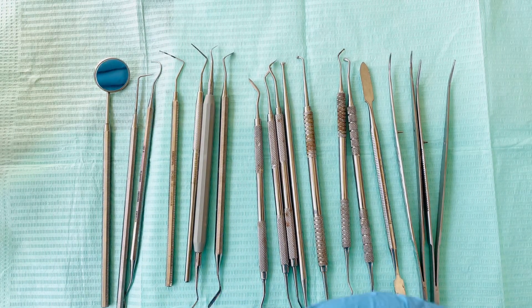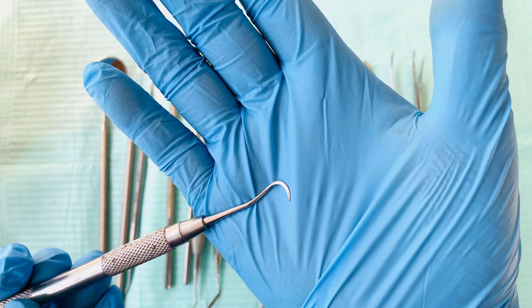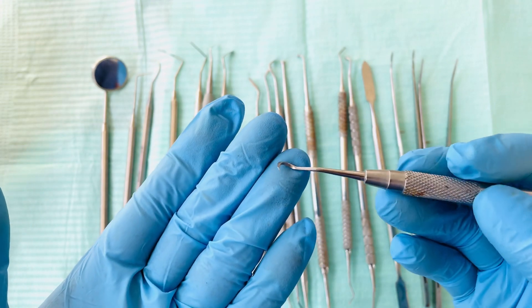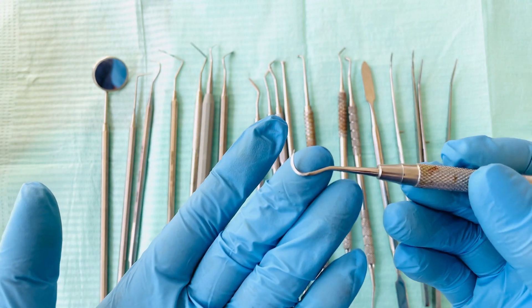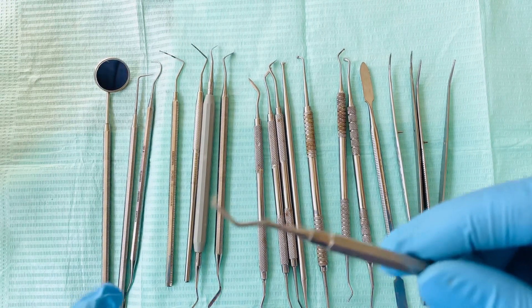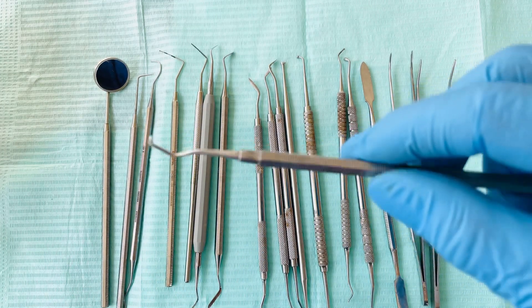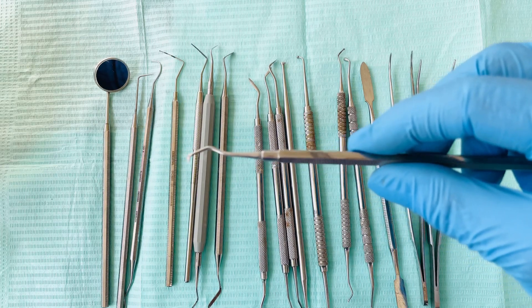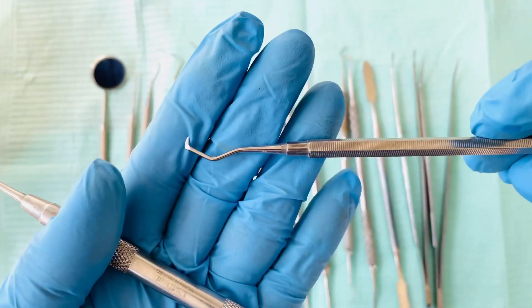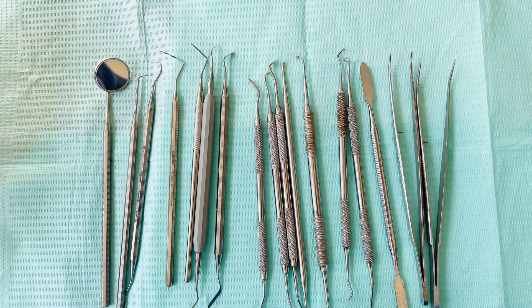We also have hand scalers. Hand scalers come in different shapes, and it all depends on which tooth you're scaling — you have to select the appropriate end for the teeth you're scaling. They also come in plastic handles and metal handles. So that's how a hand scaler looks like, and that concludes our dental hand instruments for today.